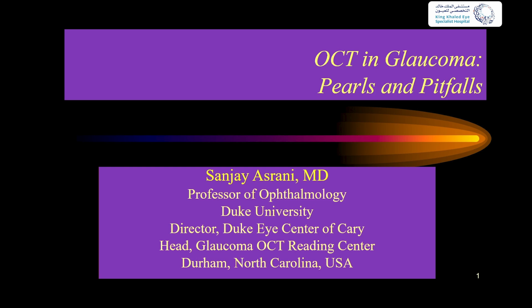And you have to also remember to do the scans. If the patient is wearing a contact lens, leave the contact lens in. You'll get a better scan. And remind the patient to keep the contact lenses in every time they get the scan. Because if you get it once without the contact lens and once with the contact lens, it'll look like progression. So, some of these are the tricks. And the biggest advantage, if they don't have central degeneration in myopia, is to look at that donut. That donut, if it is intact, there is a good chance that even if there is glaucoma, it's mild to moderate. It's not severe.